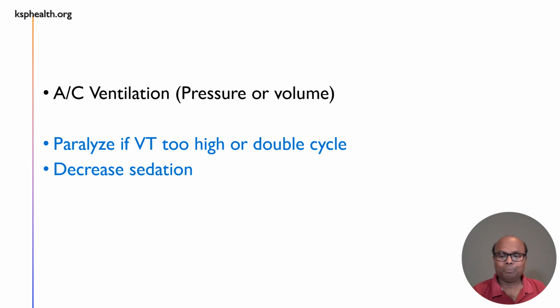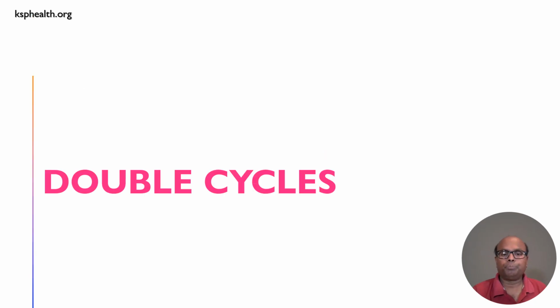It's kind of hard to call. You need to really see; it's trial and error. If you think it is more sedation, decrease sedation and see if the reverse triggering goes away. If it doesn't, you paralyze the patient and take over.